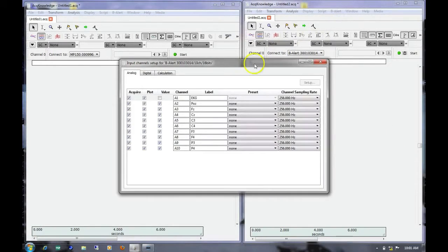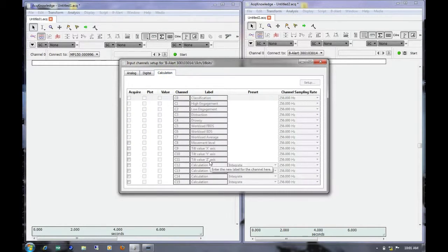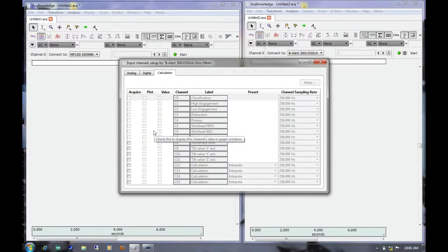If we go to Set Up Channels, I have all of the EEG channels turned on, as well as the EKG channel, which we will be using to send a trigger pulse. If you're using the Cognitive States software, you can also acquire and plot your engagement values.